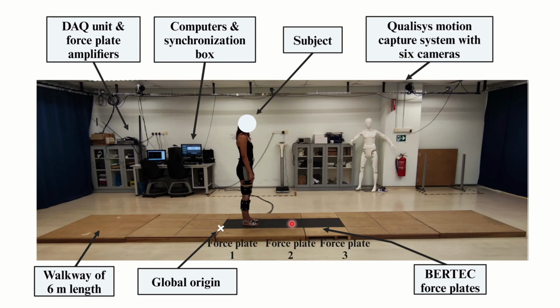You can use a synchronization box if it comes with your motion capture equipment. You can also connect all these devices to maybe a microcontroller and use a start button or a start switch, or you can supply even a 5-volt pulse to trigger each piece of equipment individually, but at the same time. Yes, there will be minor delays of maybe a couple 100 milliseconds, but these are acceptable delays.